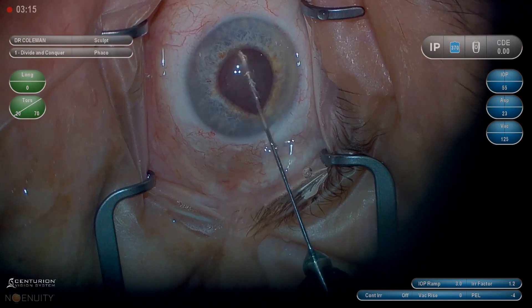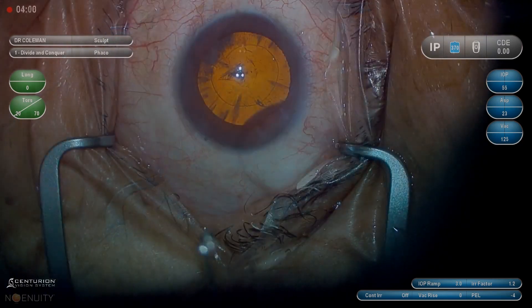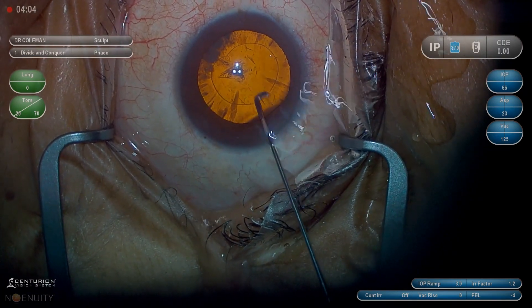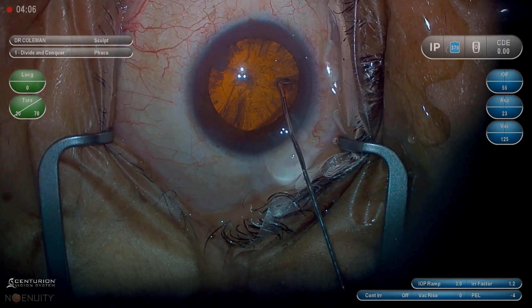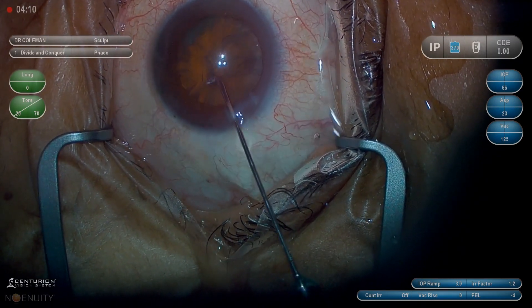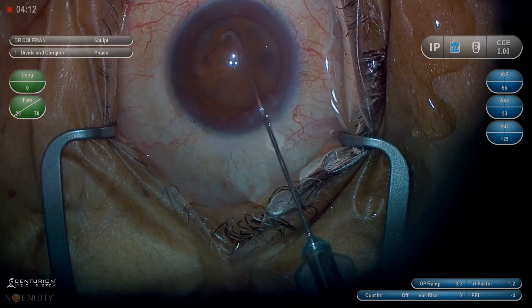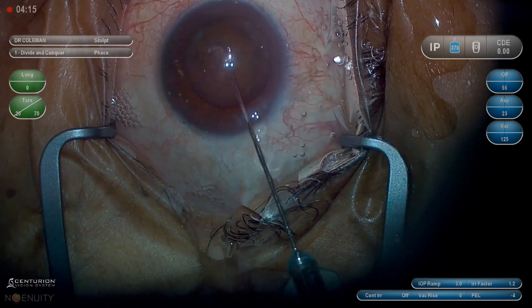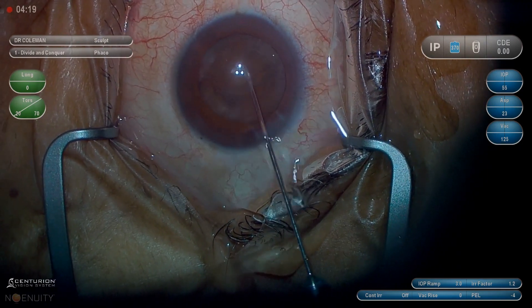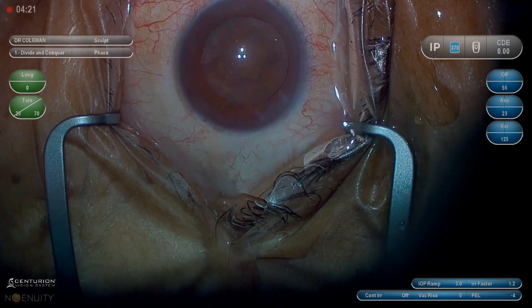So I'm looking for a definitive hydrodissection. When I go into the eye, I'm getting just under the anterior capsular leaflet, lifting up slightly so that I'm definitively in the space between the capsule and the cortex. Once I've lifted up slightly, I'm giving it a pulse — low volume, high pressure pulses — and watching for the fluid wave to come across my red reflex.